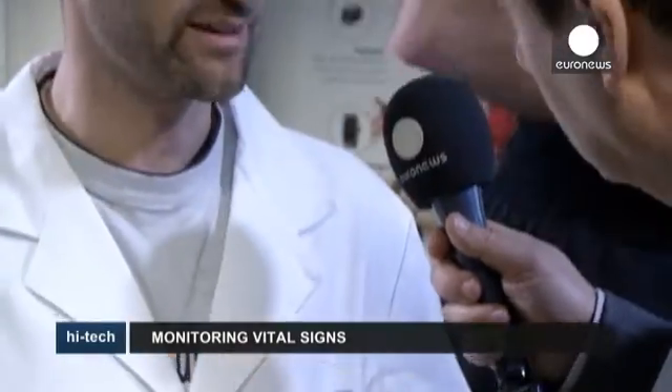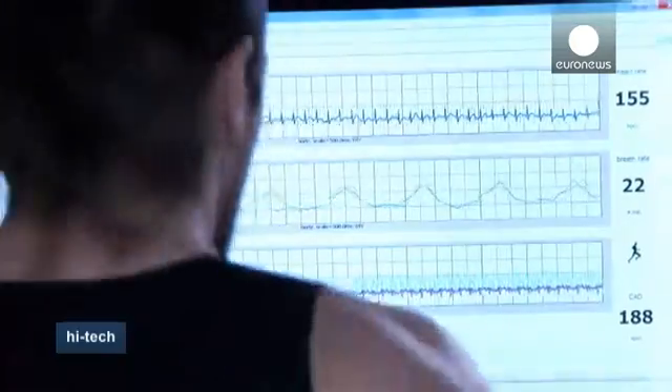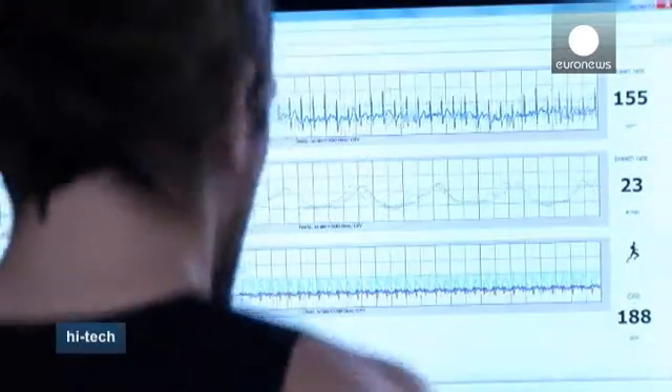The system injects an electrical current through his heart and lungs. From there we can check heart rhythm, ventilation, how many liters per minute the lungs are breathing. And we are working on developing other measures such as arterial pressure.